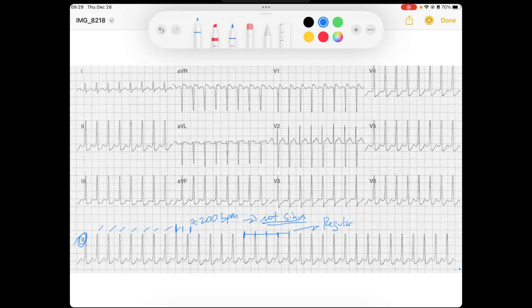If it were irregular, our differential would be something different. It's a regular, narrow complex QRS. So the first thing that comes to mind is SVT — supraventricular tachycardia. Why SVT and not VTach? We've got narrow QRSs, and we know narrow QRS means it's taking the His-Purkinje fibers with normal depolarization from the AV node down into the ventricle. So this is coming from the AV node or higher — this is definitely not a ventricular rhythm.